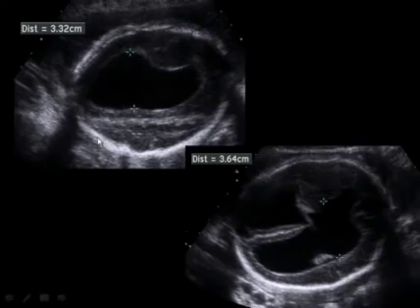Well, why does it matter? Here's an example of a fetus where we were measuring both right and left lateral ventricles, and clearly there's hydrocephalus. There's no question that these ventricles are dilated. But if you notice on this up ventricle, the measurement is 33 millimeters, but here's the falx. The presence of the falx in the back third of the head tells me that we're oblique through the head. The falx should be running right down the middle. So we have artificially increased the size of this lateral ventricle.